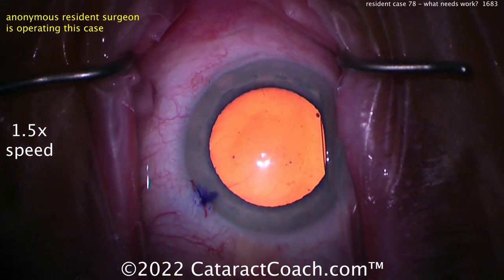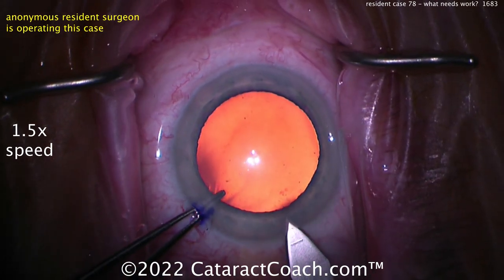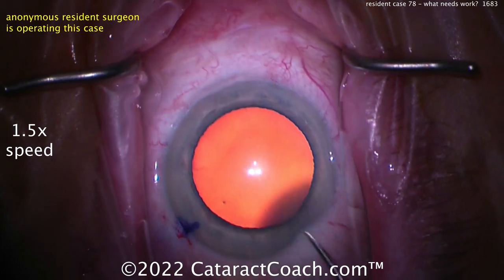Good pressure. I like how you check the pressure there. I put a little extra viscoelastic in — nice move, I like that idea. Now holding the eye, let's see the incision. Pretty good tunnel length, nice clean incision there. I like it — kind of single-planed.